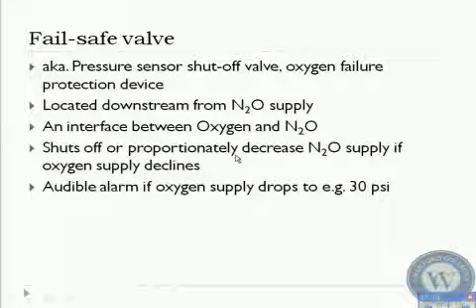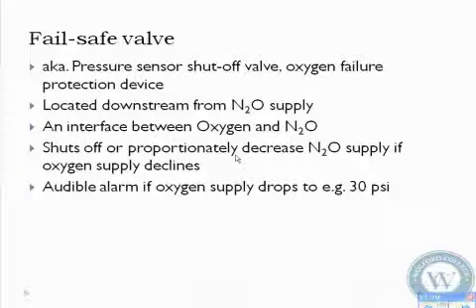So we're going with 20. Okay, I'm going to ask you that on a test. But in Dr. Dorsch's book, there's two places. One said 20 on his pictures. The other says 30 here, is when it will alarm. All this is saying is that audibly, it's going to cause an alarm at 30. But at 20, that's when it's going to shut off the fail-safe valve. Doesn't mean it's going to alarm. Okay? It just shuts it off, and then you can't deliver nitrous anymore.